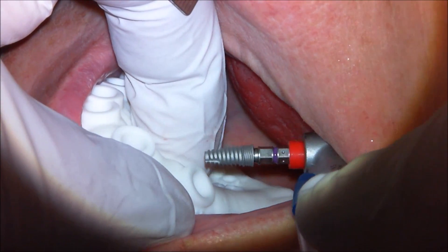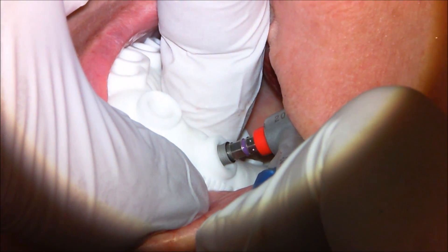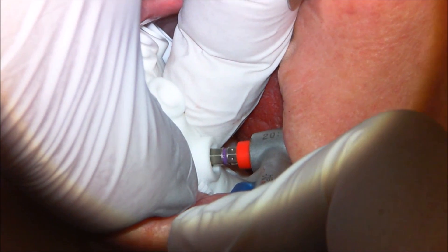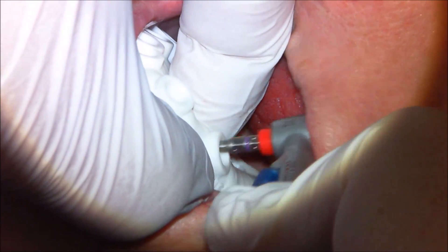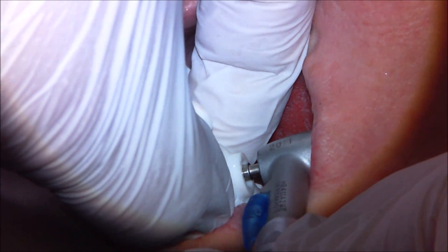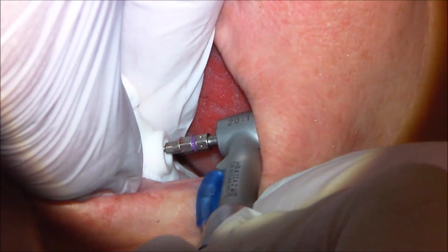I created another guide that allows me to control the depth of placement on the implants — not trajectory, but depth. I made all of the holes oversized, but it gives me a flat platform where I can measure backwards in software from the apex of the implant to the top of a guide tube. Knowing that measurement, I can measure with a finger ruler how far up on the driver it will be. With this implant, I knew I could sink it all the way to the hub of the handpiece to reach final depth. That completes that implant.